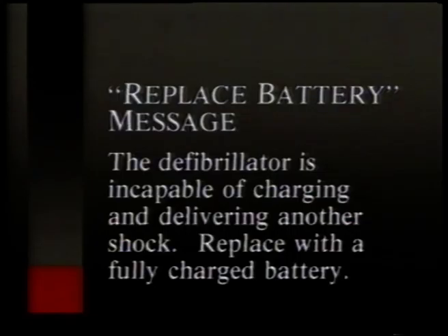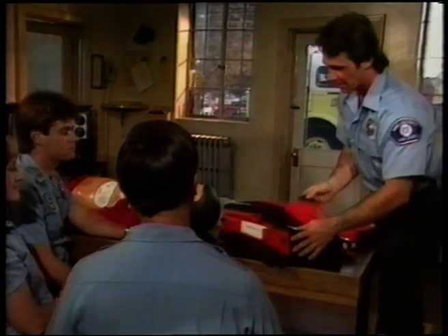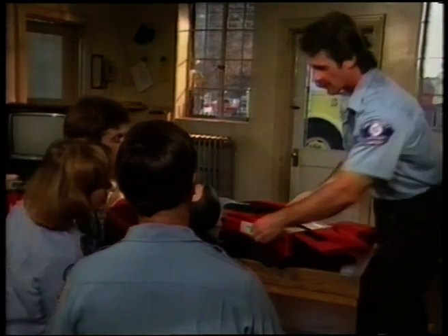Once this message appears, the LIFEPAK 300 will allow the shock to be delivered but prevent another defibrillator charge. This message may not appear before device shutdown because the defibrillator may go from the low battery state to shutdown without displaying replace battery. If either of these messages is displayed, replace the battery immediately with a fully charged battery and recharge the depleted battery.